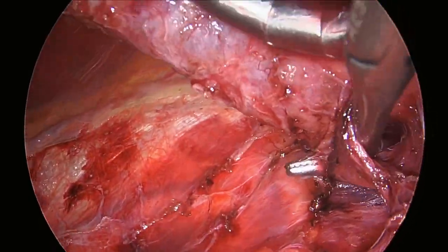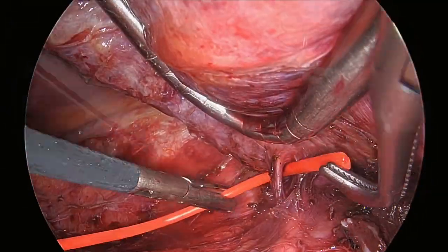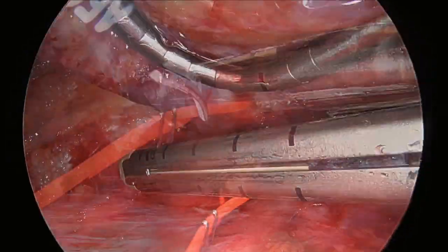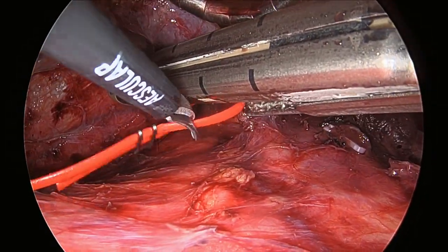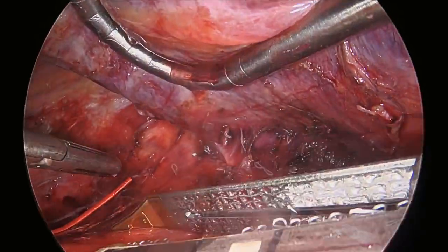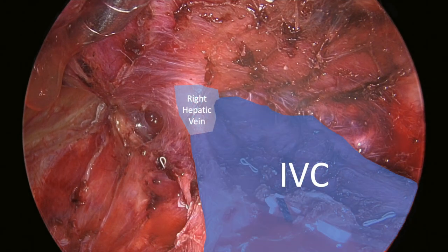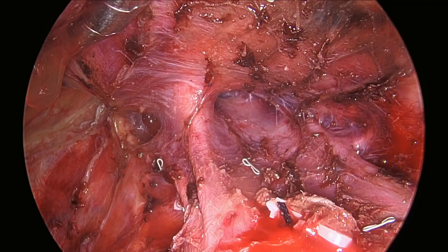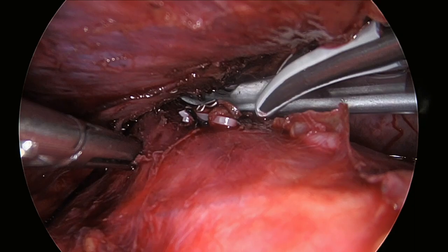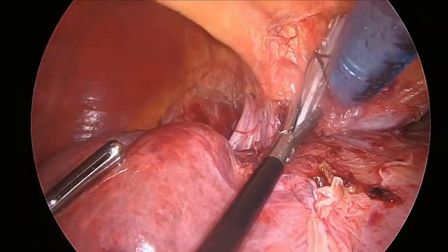As the dissection continues cranially, the caudate ligament is then isolated and divided with an endo-GIA stapler. At this point, we have a great view of the right hepatic vein insertion on the inferior vena cava, with the groove between the right and middle veins identified. A nasogastric tube is passed between the groove to help with preventing any inadvertent injury to the right vein during the parenchymal dissection, and to help with any sort of possible hanging maneuver.